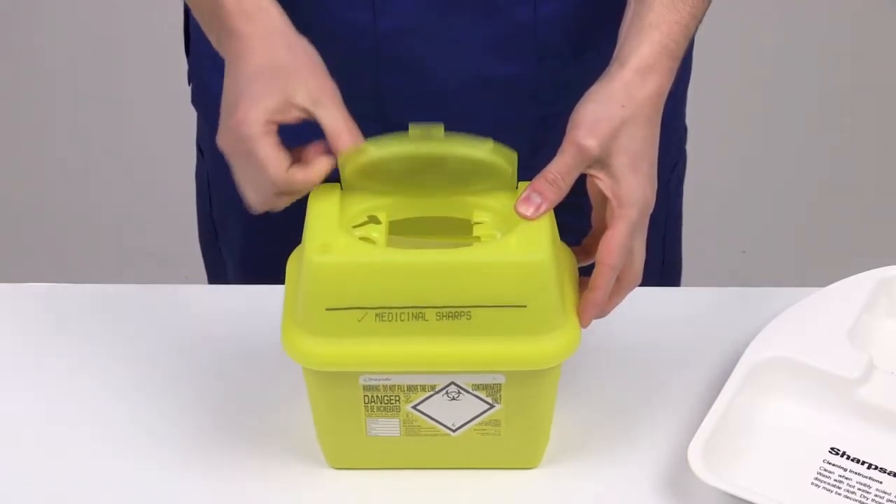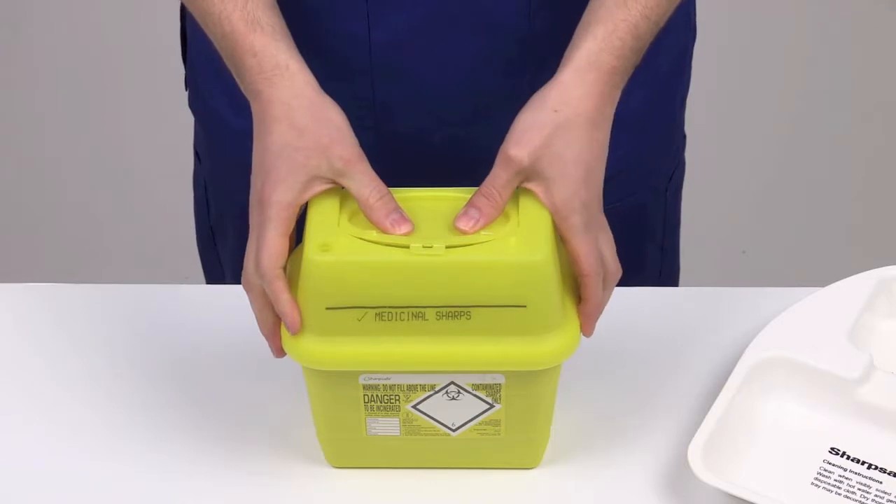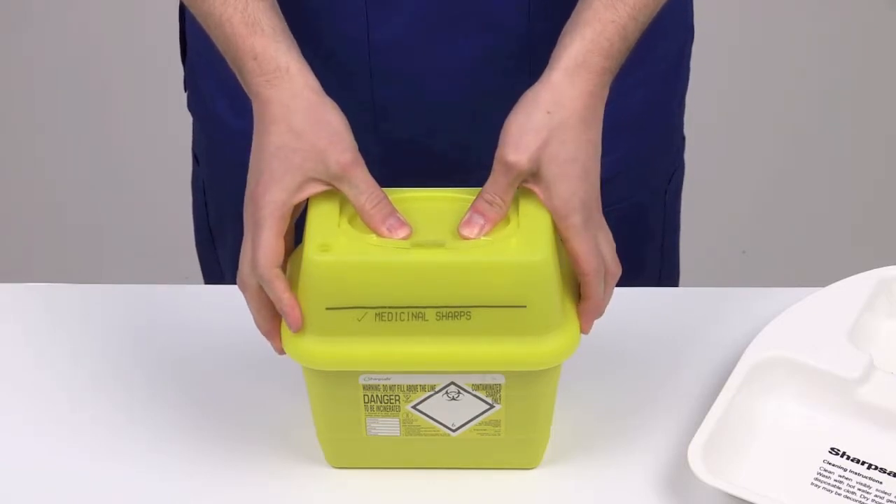Rotate the lid up until it covers the aperture. Continue to close the lid until a click is heard. This indicates the container is now in temporary closure.